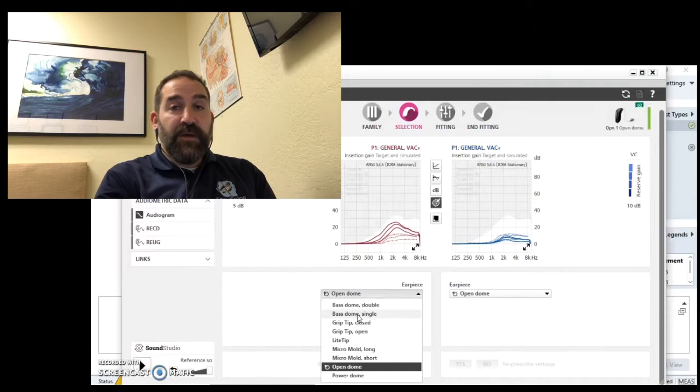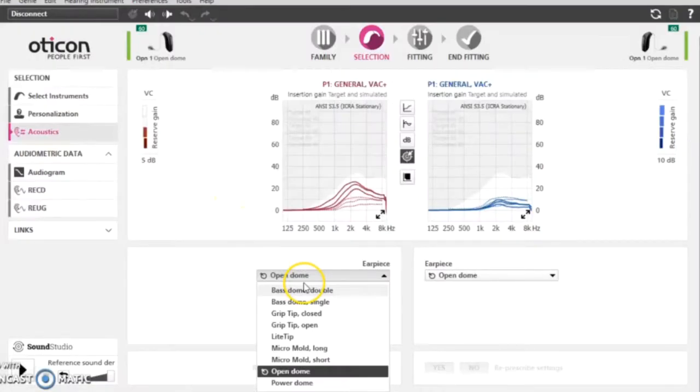If we need a little bit of bass amplification, then we need a closed dome — or what we have here, a bass dome, what's called double, which means it has two vents rather than one vent. They're still venting, so it's not plugging your ear up completely. You're not going to feel like your head's plugged up, but it gives us a little bit more bass and we can get a little bit more of the mid-range as well. It also allows us to have more control over background noise, which is a big complaint — people having trouble with background noise. By having a slightly closed dome, we can block out some background sounds and the hearing aid can actually deal with them better and minimize background noise more effectively.